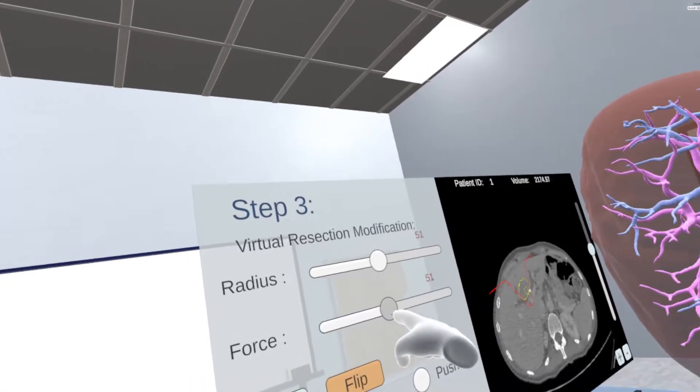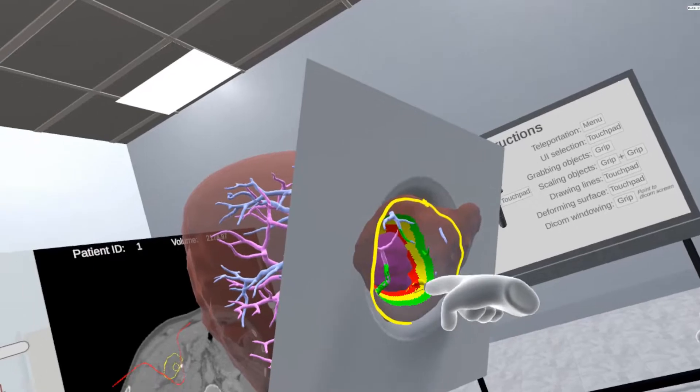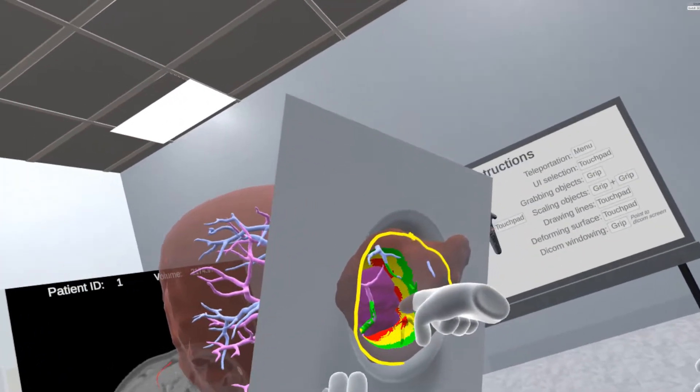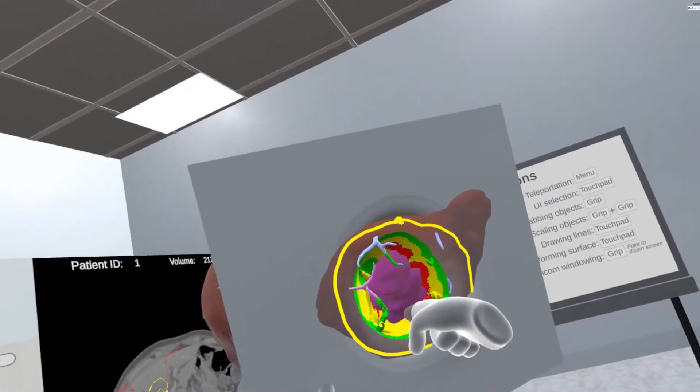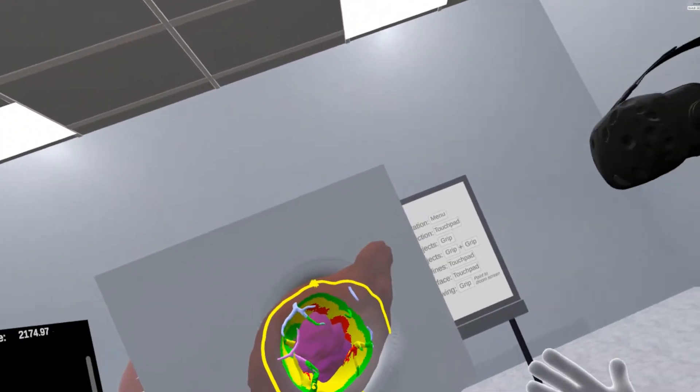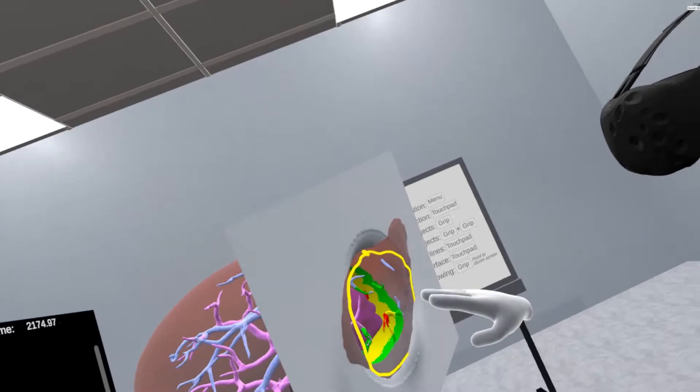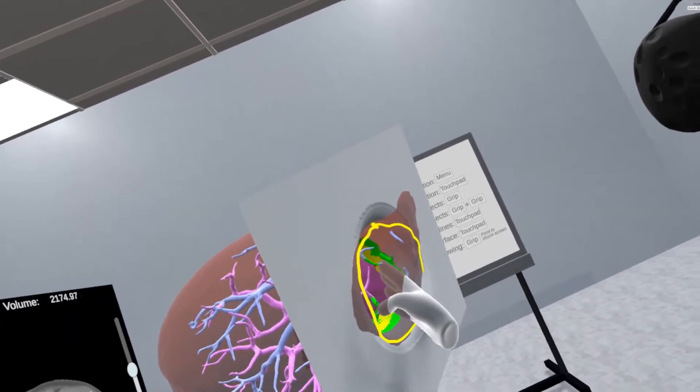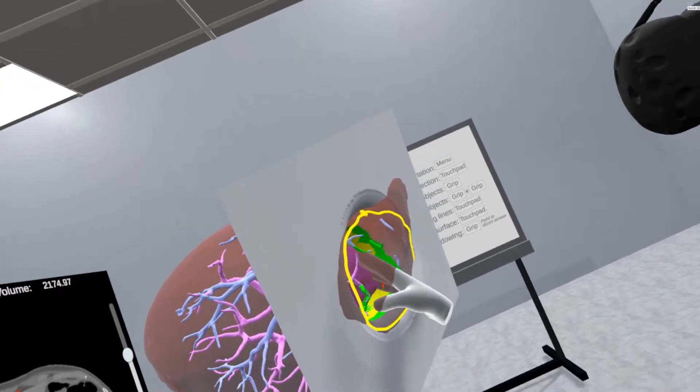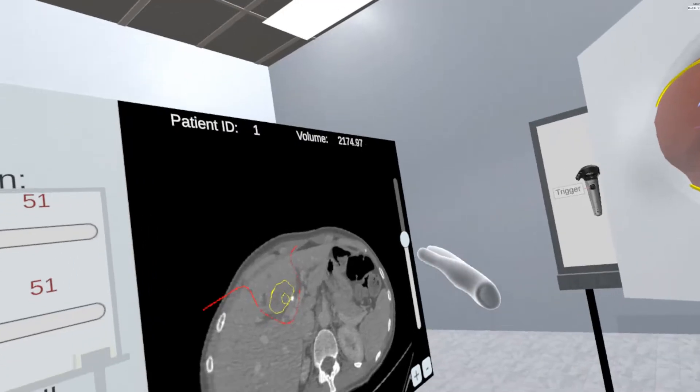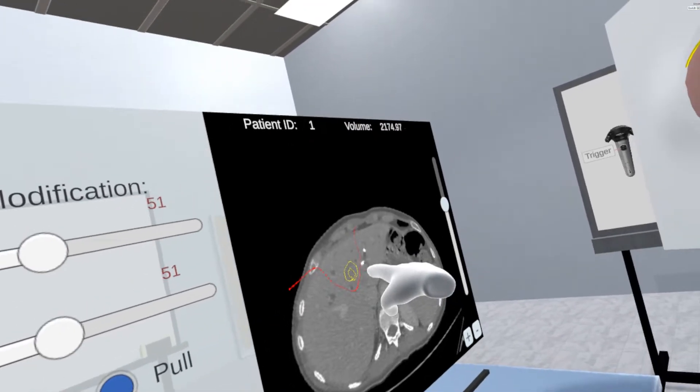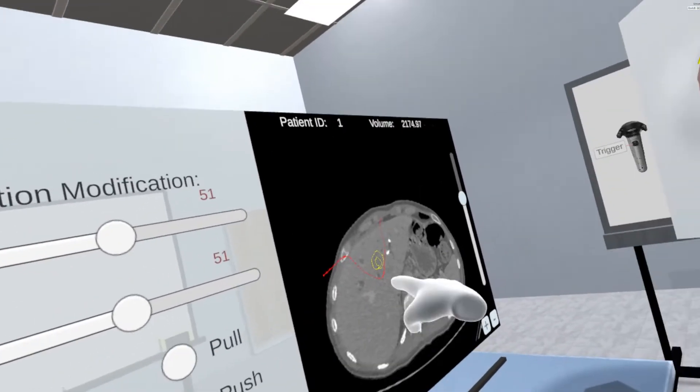For modification, various options are provided for the users to refine the resection surface. Real-time risk maps visualization from the resection surface to the tumor are displayed for visual feedback. The idea is to provide support for the planning to keep the safety margin around the tumor. The system also allows modification on the 2D view and the modification is synchronized for both representations.